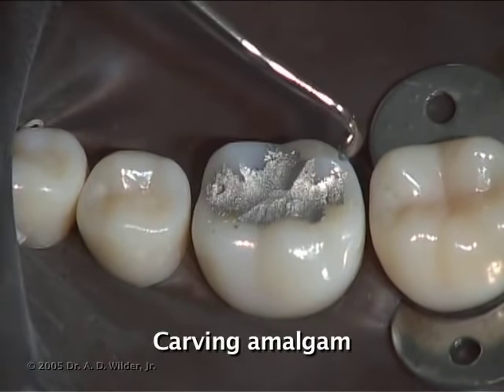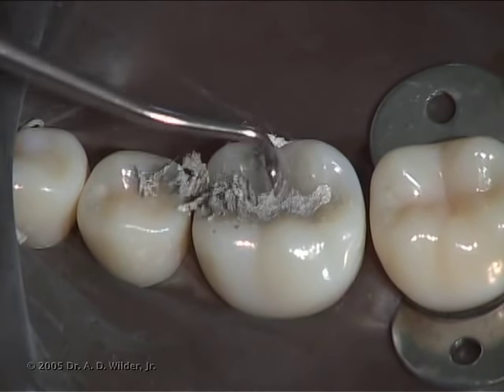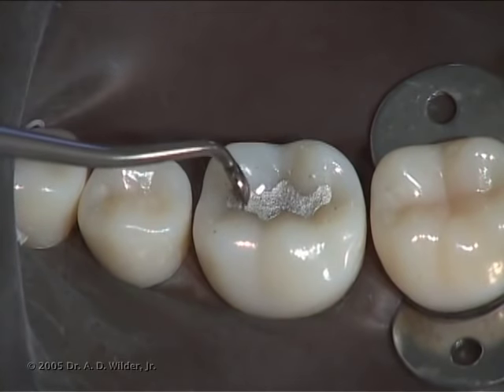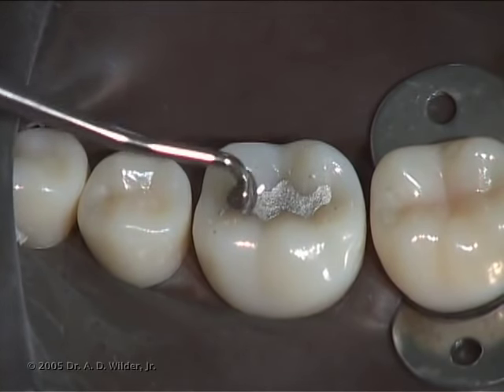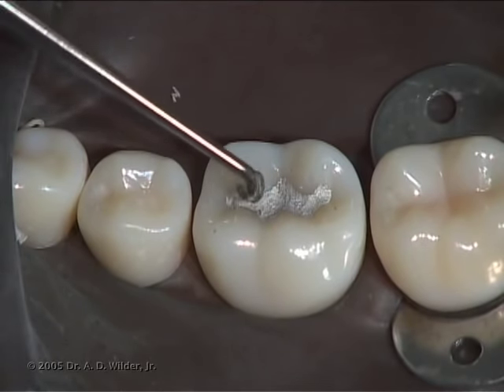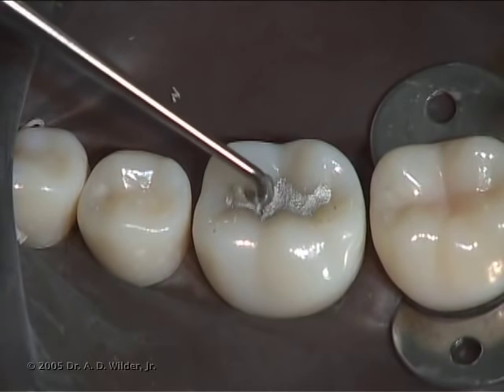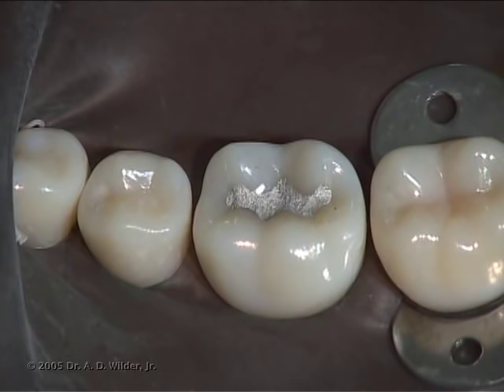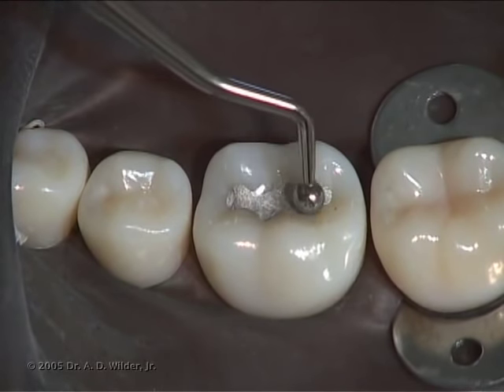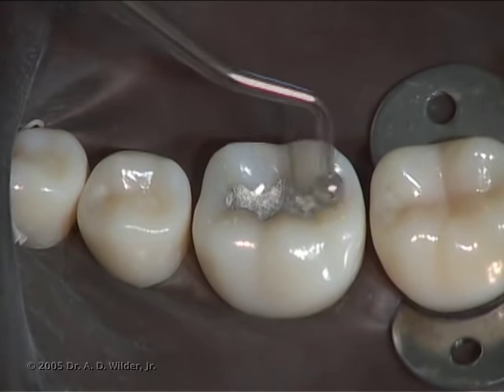With a cleoid discoid instrument, you can begin to develop the anatomy of the final restoration. Always make sure that part of the instrument is on the tooth surface and part is on the amalgam. Move the working end of the instrument parallel to the CAVO surface margin. The carving process should take place during the onset of the amalgam setting. At the end of setting, you can perform some post-carving burnishing to solidify and further highlight the primary anatomy of your restoration.